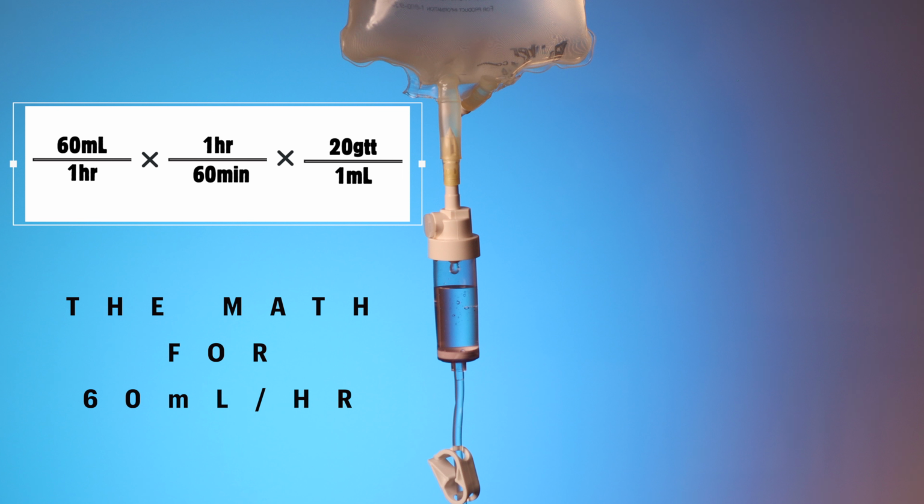This is our second drip rate of 60 mLs per hour. You can see the math on the screen here.